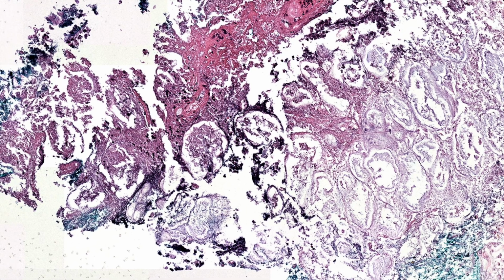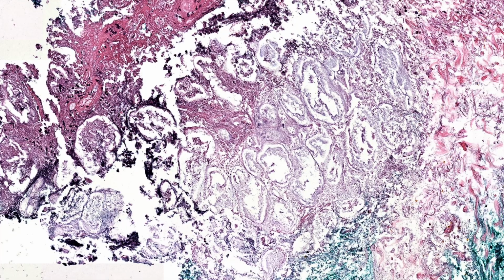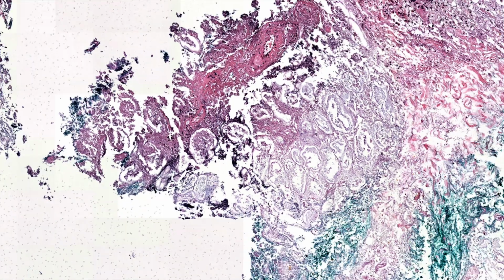So the idea here is that a person has pancreatitis or maybe a pancreatic tumor, something that's causing pancreatic lipase enzyme to spill out of the normal place it should be, which is in the tubules and ducts going to the GI tract to help dissolve fatty meals. Instead, it gets into the bloodstream, and the high levels of lipase get into the subcutis and dissolve and necrose the adipose tissue by breaking down the lipid. And then it secondarily gets calcification, giving this saponification pattern of fat. It sometimes may have inflammation with it too.